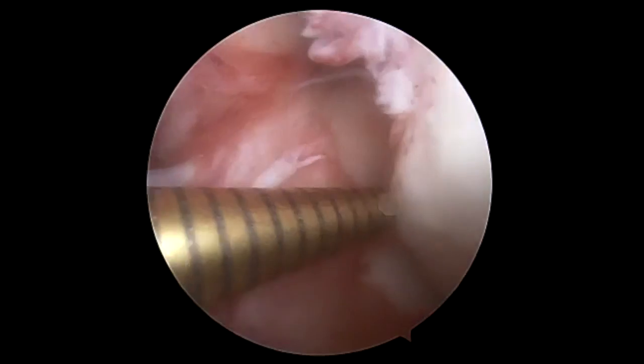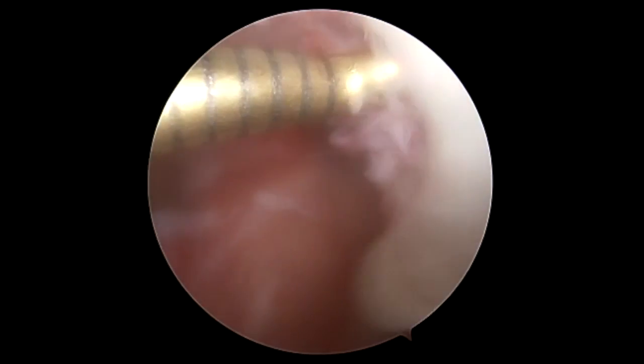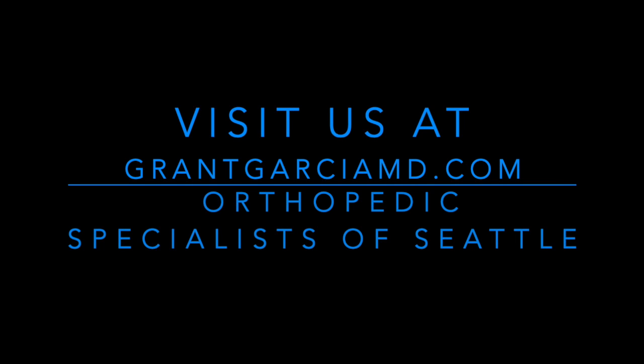Then we're going to turn attention to microfracturing the notch, which has shown in a number of studies to increase the healing potential, essentially simulating an ACL tear and bringing in stem cells.